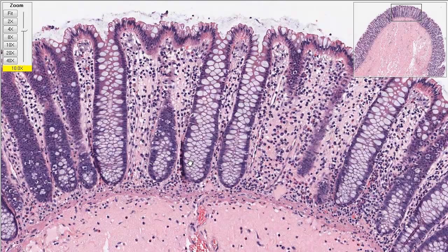When you say it's an epithelium, it's kind of like the stuff that's facing the outside world. Yeah, so the epithelium is a special class of cells in which they are facing the outside world, once again, tightly packed. And there's always a top and a bottom that are different. And even though to a lay person, this area right here might not seem like the outside world, it seems like it's inside of you. We're kind of like big donuts. That's right. And the colonoscopist proves that it's connected to the outside world. They can come right in there, at great pain and expense. So that is still the outside world. And so this is the architecture where you have infoldings to increase the surface area, and it's creating this mucus.